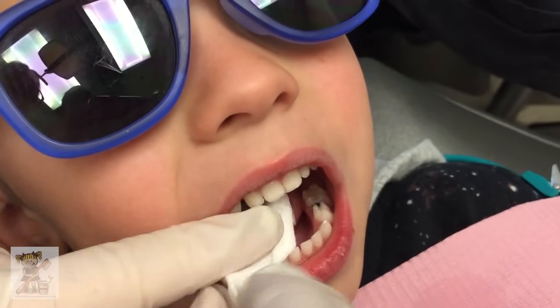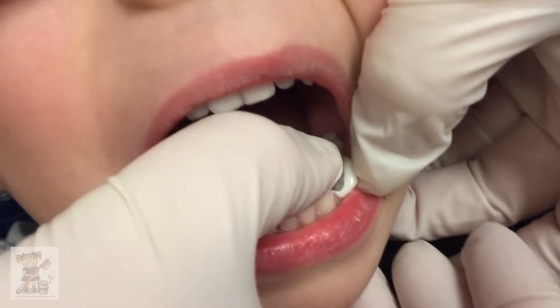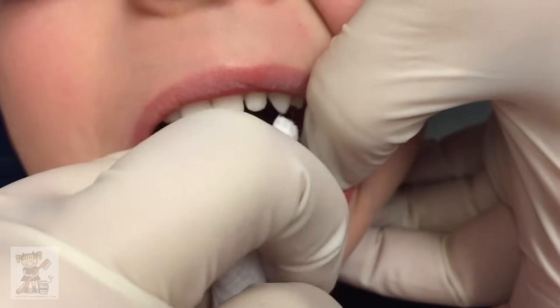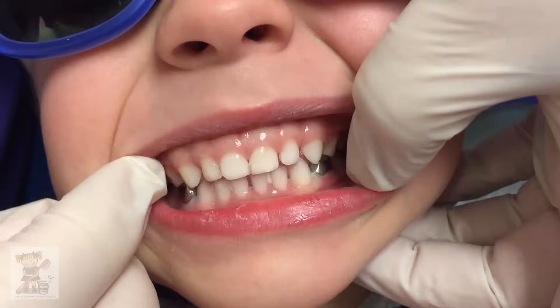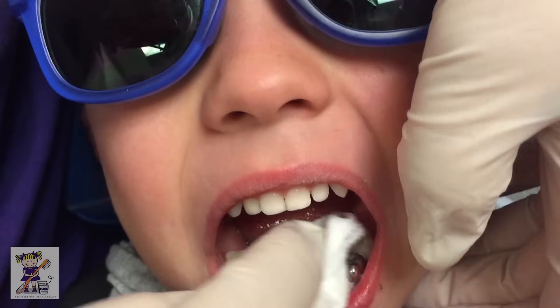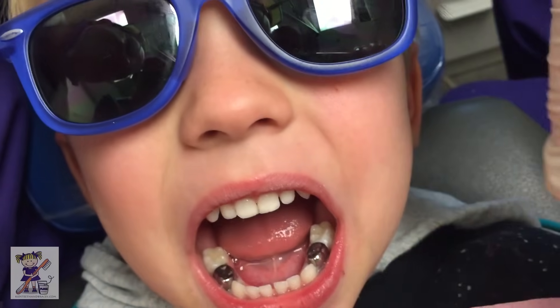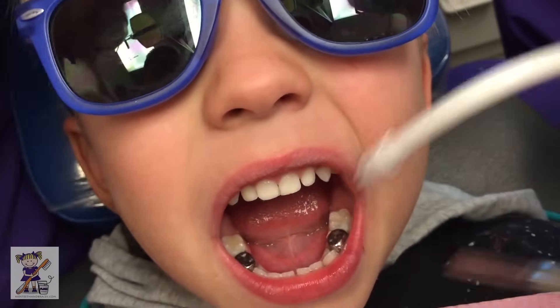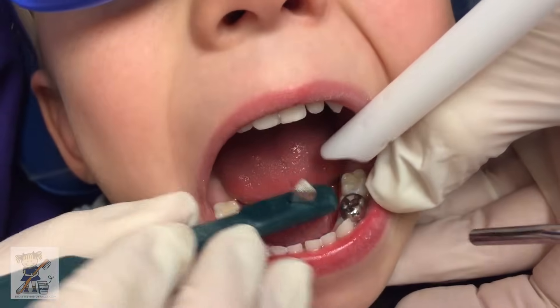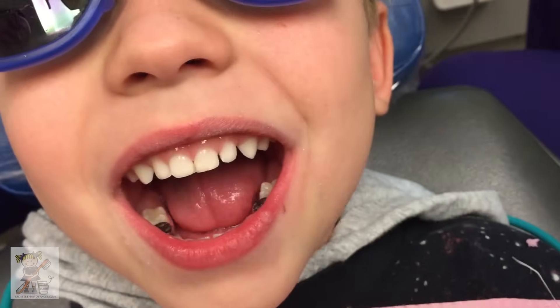If everyone was as good as you there would not be a need for my specialty. So now we have our next crown loaded. We're seating it with firm finger pressure and then I'm going to have him help me. It's a little tight when it goes down but he's such a good kiddo. Can you bite your teeth together really tight? Like you're Spider-Man! Look at his bite — not bad, huh? We're going to wipe off the glue. We're going to floss and do a little rinsing.